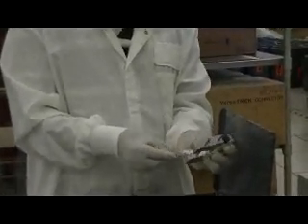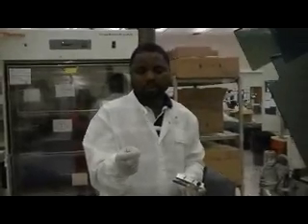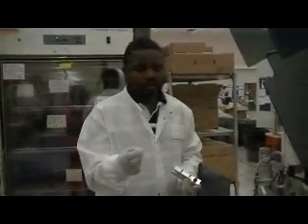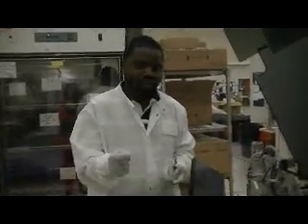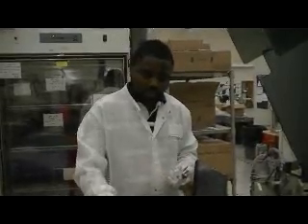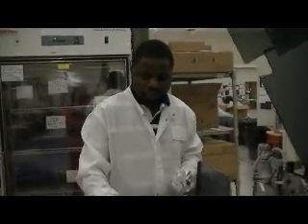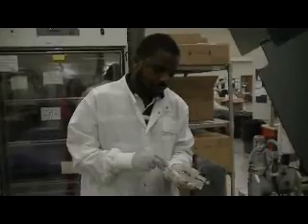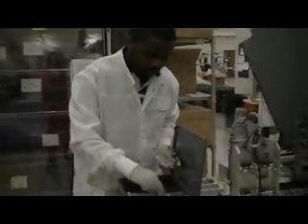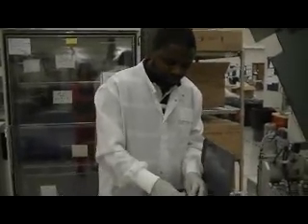So this is the tool that we use to bend our loops, because when you order your loops, they'll come in like this. Depending on the number of specimens that you run per night, this one can last you up to a month if you clean it properly and take good care of it, and if it is calibrated. Because at times if it is not calibrated, when it's dipping down into the urine, it will hit right on top of the urine tube and it will bend. After that it will be useless. Then you have to replace it with a new one. Usually they will last you quite a bit. So that's the tool that you use to bend your loop.